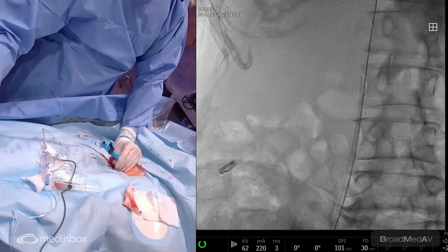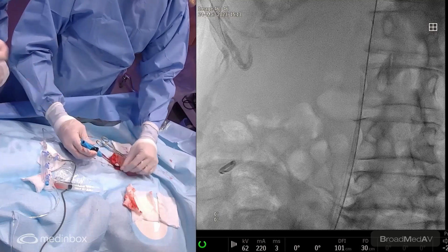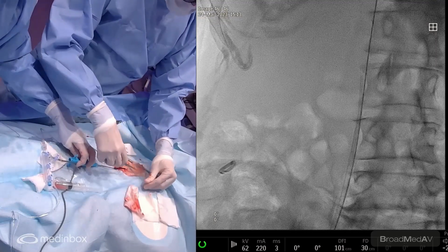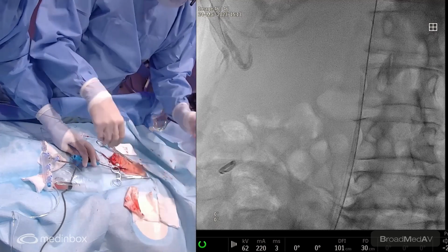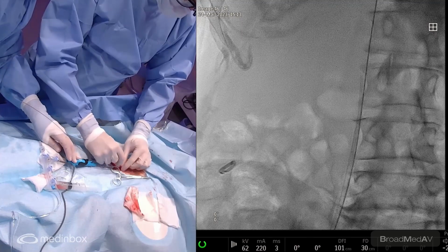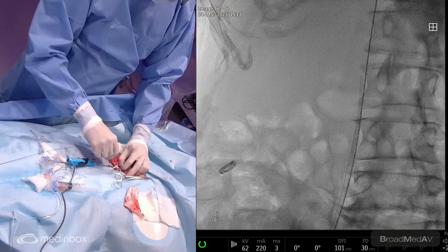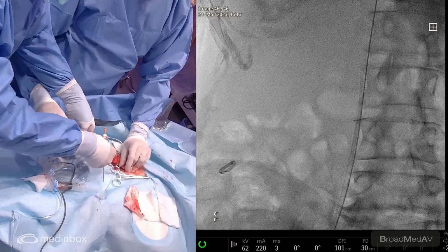So he's deploying the needle, cutting the rope like this. It will close the feet and then remove just the device from the vein. There's two sutures that we will put aside, just to try and make clear which one is on either side. So typically one on the left side, one on the right side, not to get them tangled. Okay, cool. And then now he's reintroducing the wire inside the vein, and we'll put the second introducer in place.